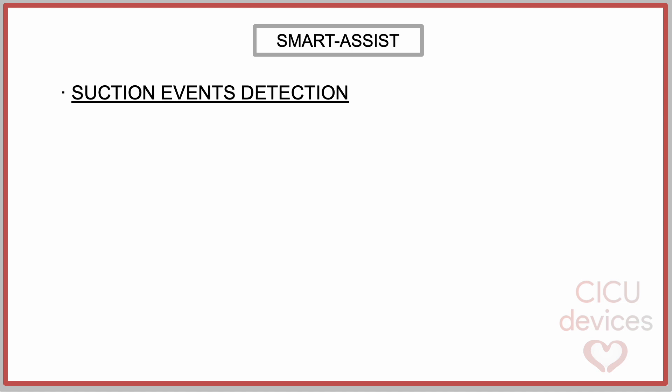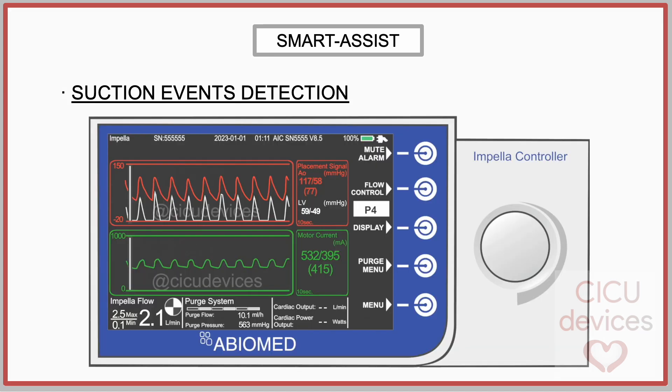Suction Events Detection: Due to the use of the digital pressure sensor and continuous monitoring of the left ventricle pressure, the device can detect suction events earlier. In this animation, we present a continuous suction event throughout diastole.